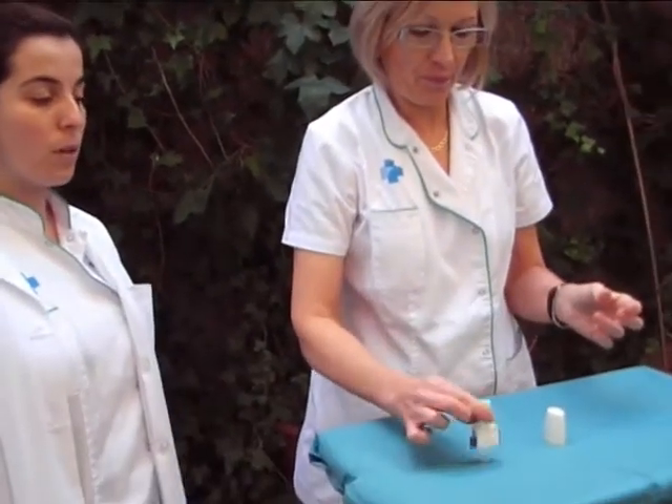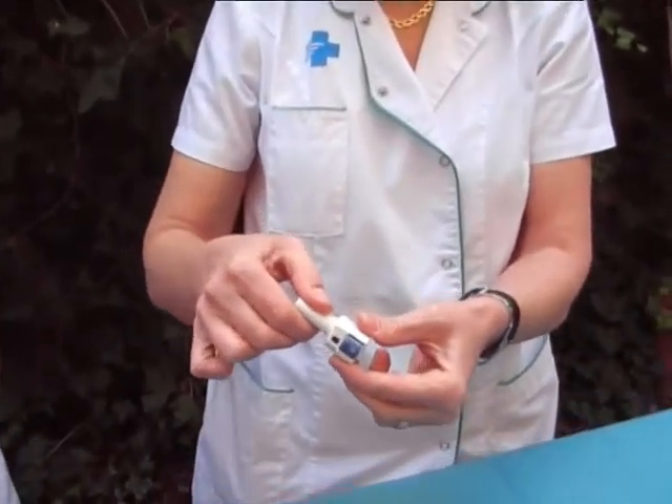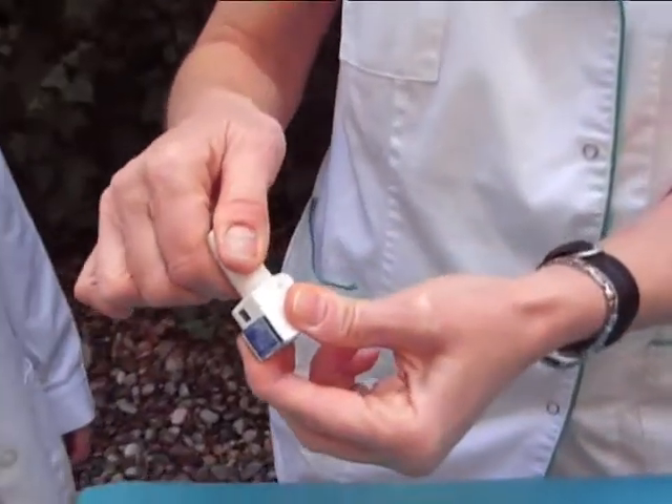When doing the inhalation, you should hear a very peculiar noise. If this is not the case, the capsule is most probably stuck. To solve this problem, you should gently shake the inhaler against any surface and breathe in again.